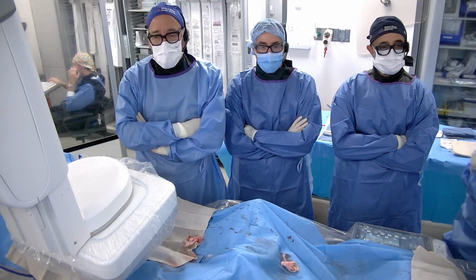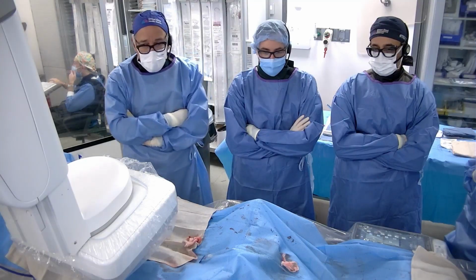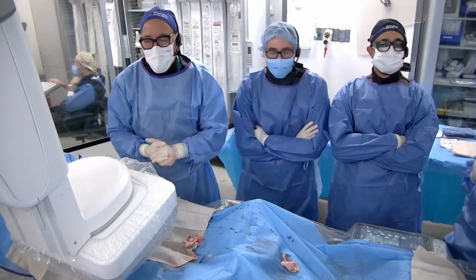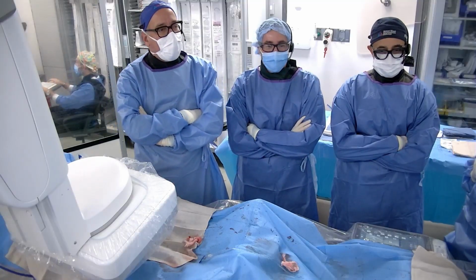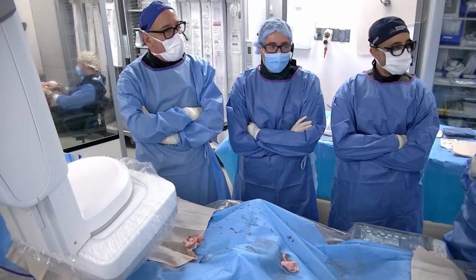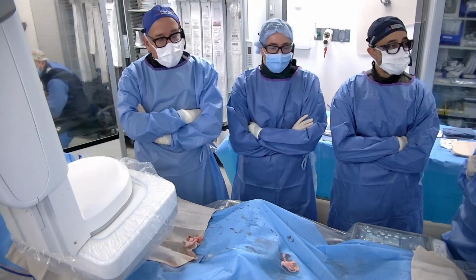How much time do we have left? I just want to be sensitive to that. We have 1 minute and 30 seconds. All right. So I don't want to get involved with too much stuff, but I think if we could set up the Penumbra system, that would be great. All right.